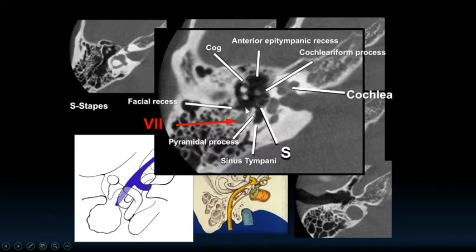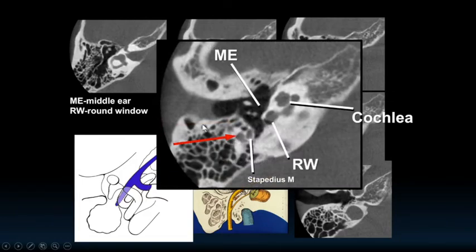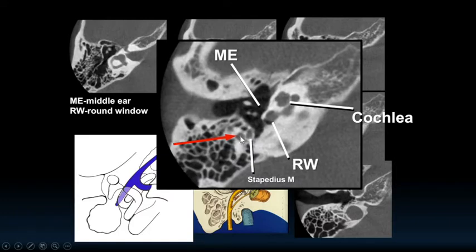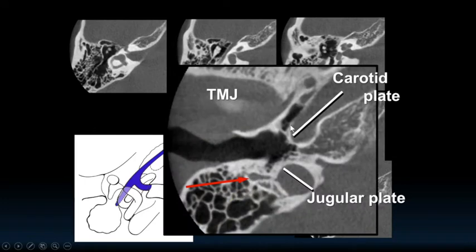Dropping down further, you see the external canal, all turns of the cochlea, the round window membrane, the malleus, incus, stapes, and the stapedius muscle with the facial nerve again in cross section. Then at the lowest level, the carotid plate, jugular plate, and so on. That anatomy is really the basics — if you're just starting out, learn that along with the diagram and you'll be in pretty good shape.